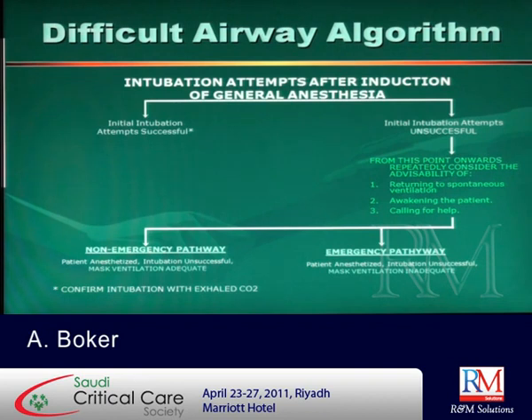Adjust the patient's head. Reposition the mask. Oral airway. Nasal airway after decongestion. What else? Two-hand ventilation, two people ventilating. Those are all important steps.